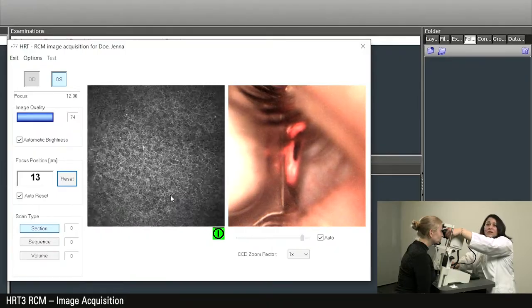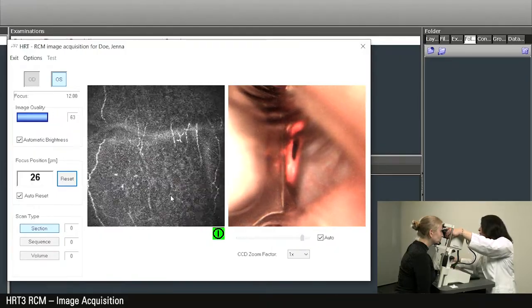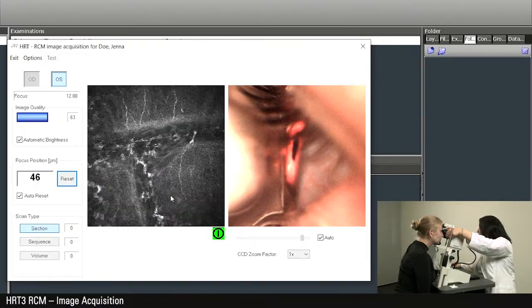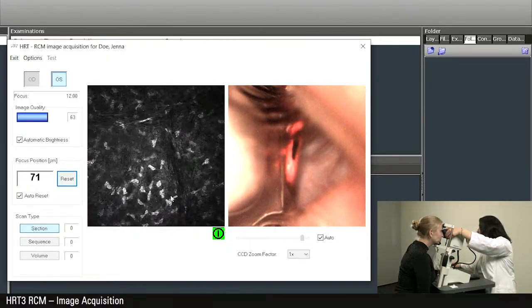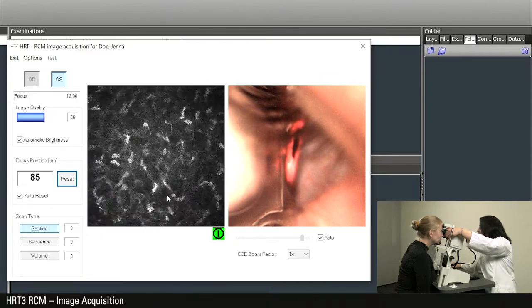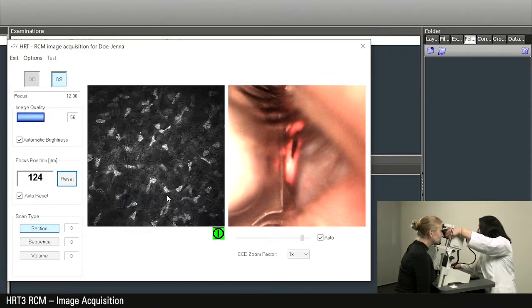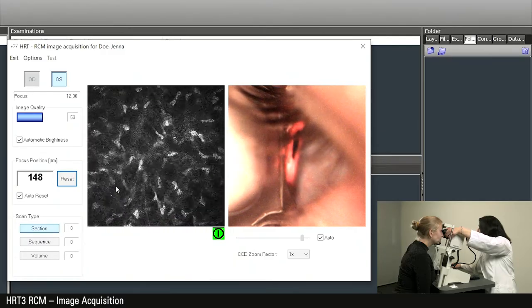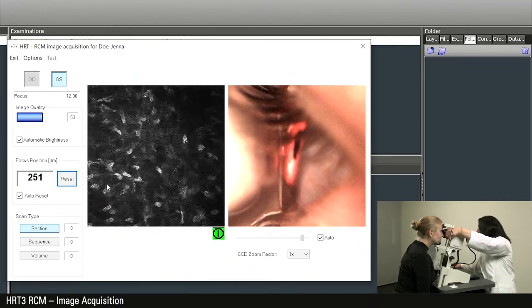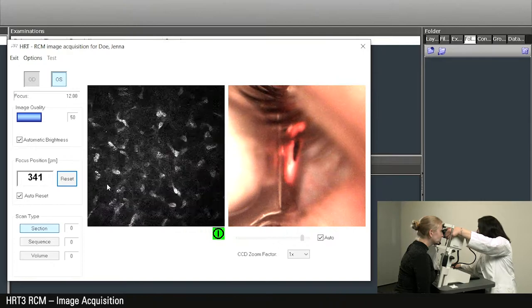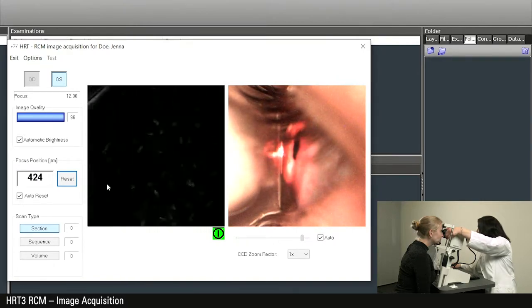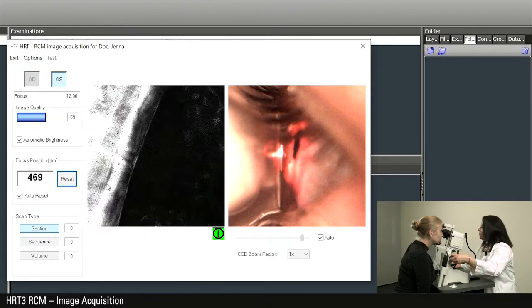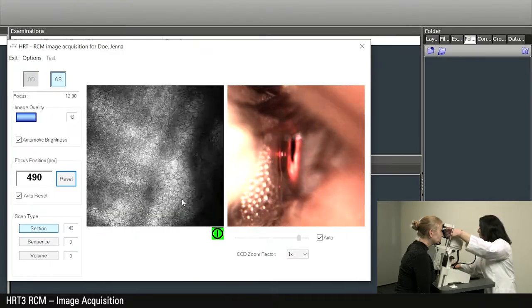Press reset again and now turn the objective wheel clockwise to reach the deeper corneal layers. We can see the different types of corneal cell layers with the corneal nerve fibers, the stroma, and the deeper you get, you reach at about 500 microns the endothelium.